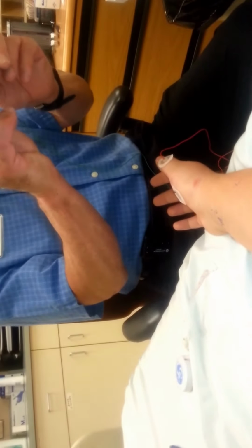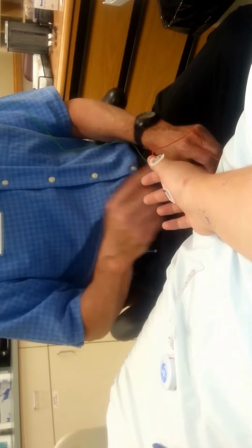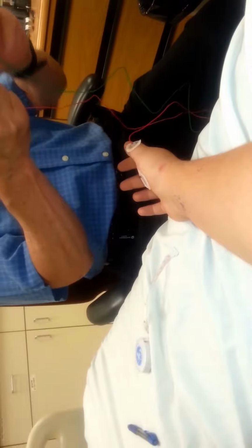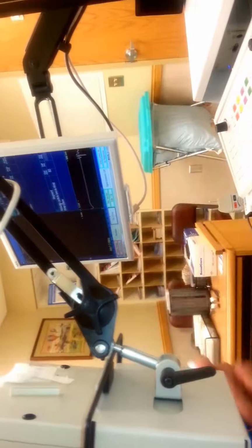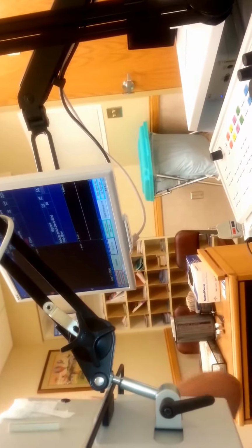A normal speed for this signal to travel from here, where I'm going to shock you across the carpal tunnel, to that thumb is 4.5 thousandths of a second or less. And so we're going to record the signals up on the computer screen. And we use electrode gel here to improve the conduction between the stimulator and your skin.